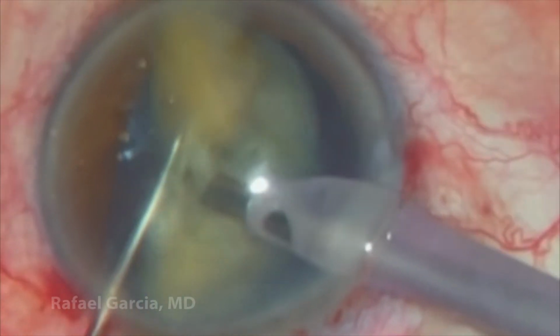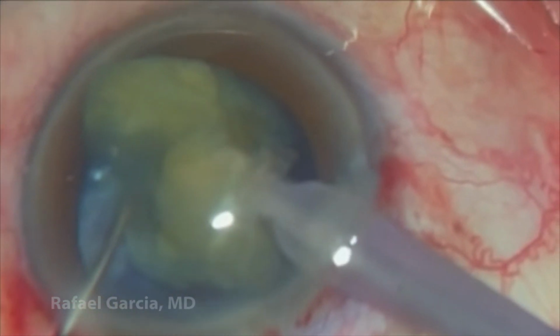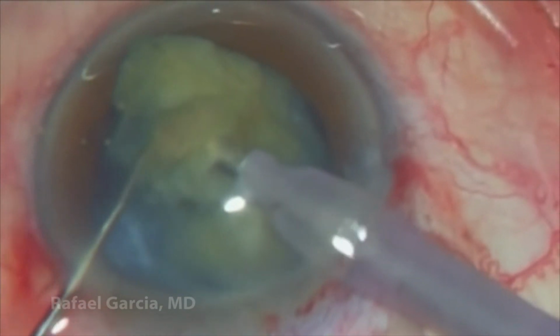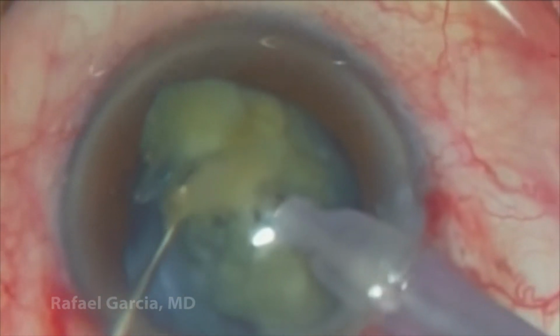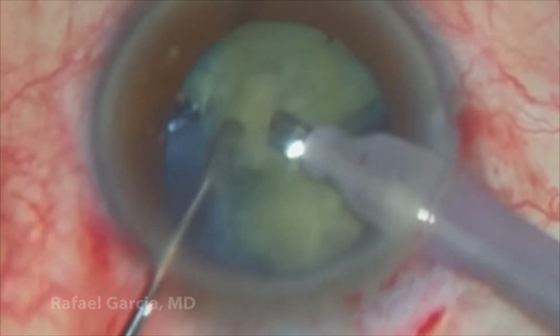As there's almost no cortex or epinucleus around this cataract, it floats freely inside the capsular bag, and we must be very cautious in our chop maneuvers in order to avoid any damage to the posterior capsule. So we take our time here, debulking this nucleus. Using ultrasonic power modulation, the pieces are progressively emulsified. We can notice that it's quite a dense cataract.